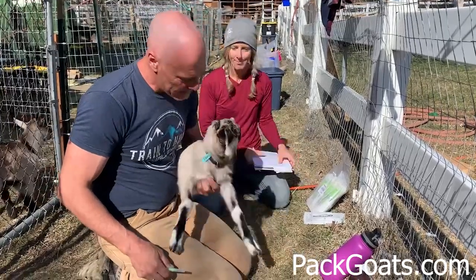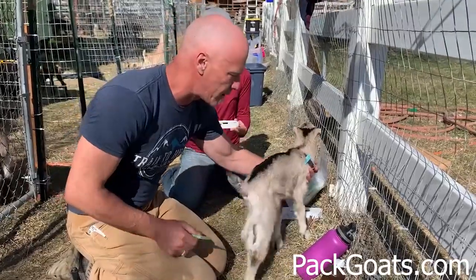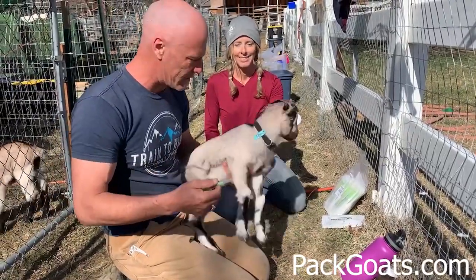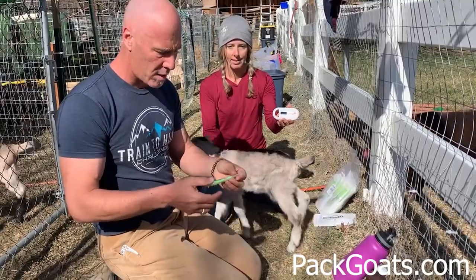Hi, Mark Wernke here, Patgoats.com. I want to let you know that we're changing our system this year and we're microchipping all of our babies before they leave the property. Christy here is helping me and we're going to show you how to do this and educate you on it, because you can get these on our website and order them.